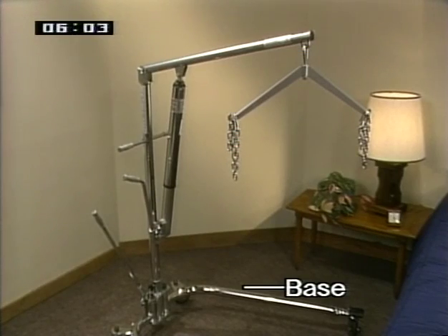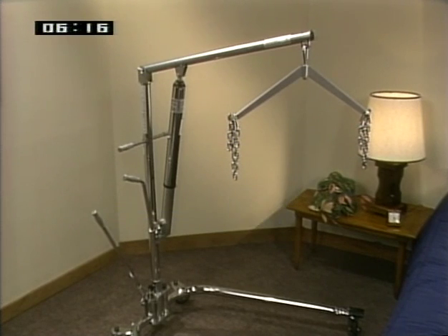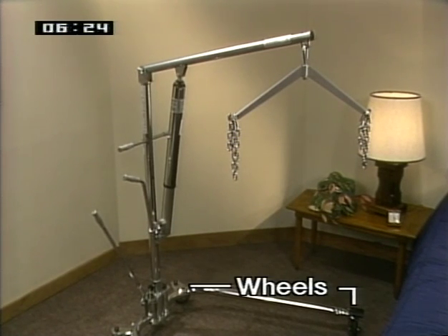The lift rests on a base. The most common form of base is the adjustable U-base. The handle lever allows you to adjust the space between the wheels so the lift can fit under the bed or around the chair. The base legs should be spread to the widest possible position when lifting someone to maintain stability. The base of the lift has wheels.